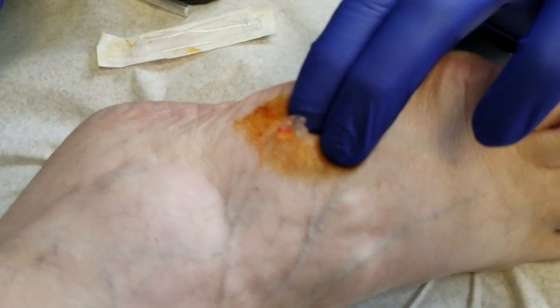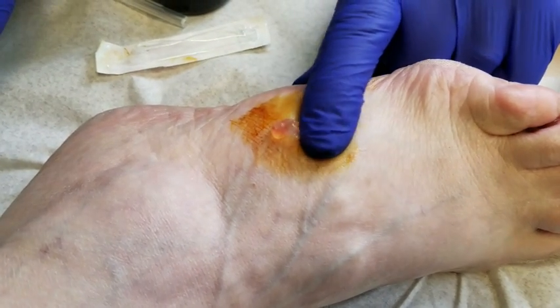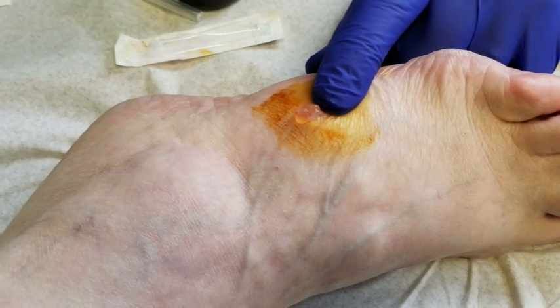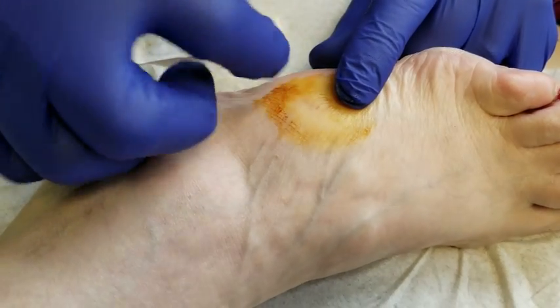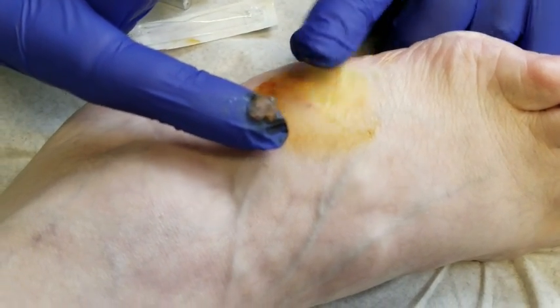There's the ganglionic fluid coming out. You can see that. And versus aspirating, this is a nice, easy way to fairly painlessly take care of it. There's the fluid that came out of the ganglion.